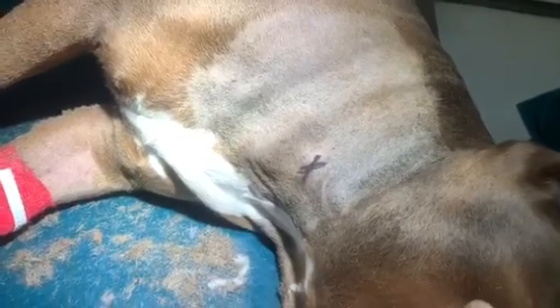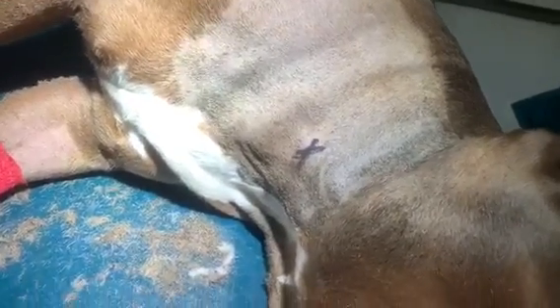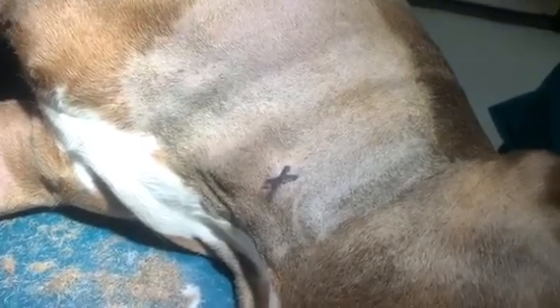The surgical prep looks as such. There is a black sharpie mark on his neck, which coincides with the 23-gauge needle you saw in the x-ray taken in preparation. Approximately that area is where we'll make our incision. This is the caval syndrome surgery approach, with the dog in left lateral recumbency, right jugular vein.